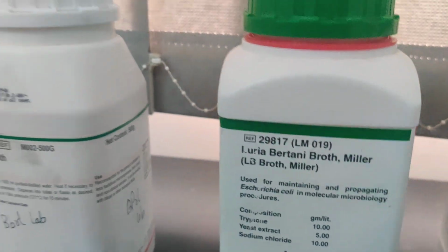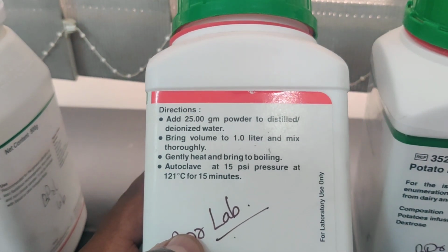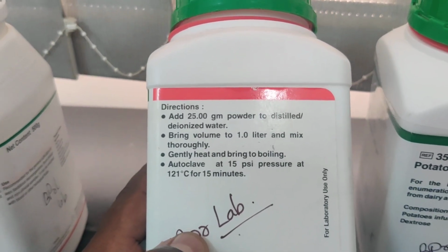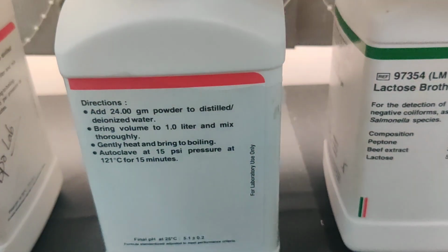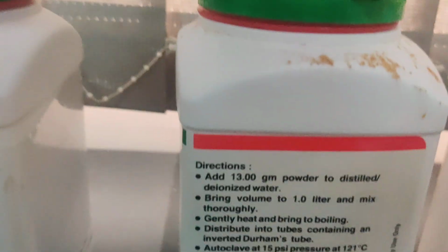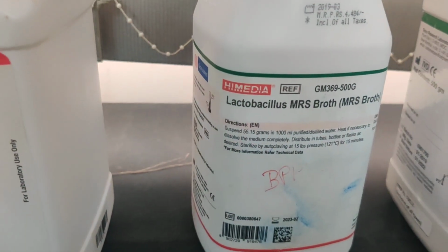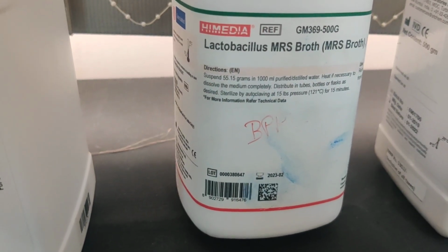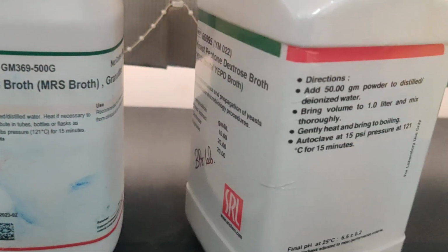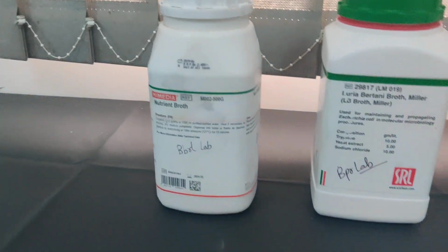The same way if you go for LB broth, they would have given the directions. Add 25 grams powder to distilled water, bring the volume up to 1 liter, mix it gently and then autoclave it. The same way for potato dextrose broth, they would have given some directions. And for your lactose broth, they have given the procedure. And for Lactobacillus MRS broth, selective broth, they have given suspend 55.15 grams in 1 liter. And then YPD agar for yeast, if you see, 50 grams. All the units that I have given here are for 1000 ml.